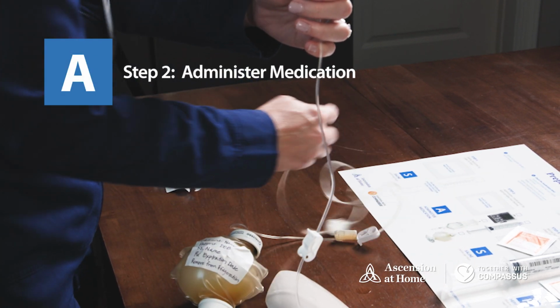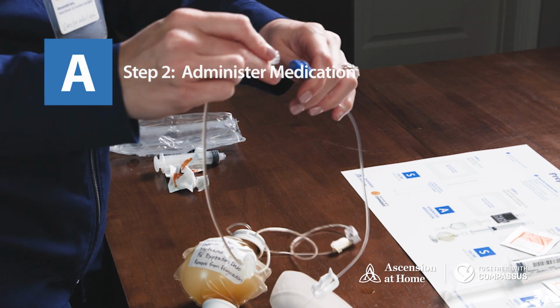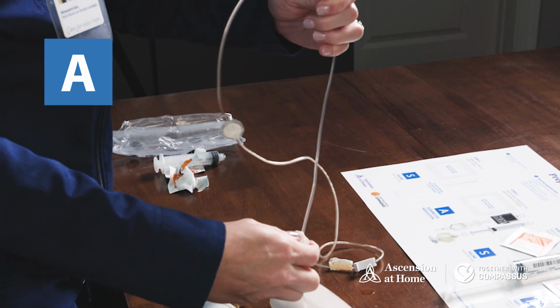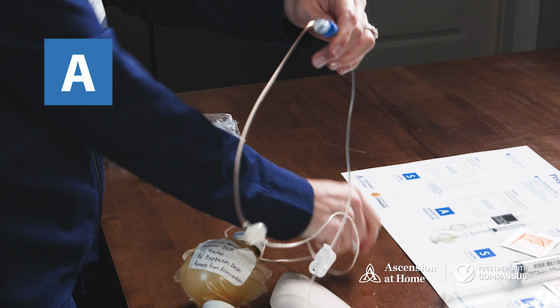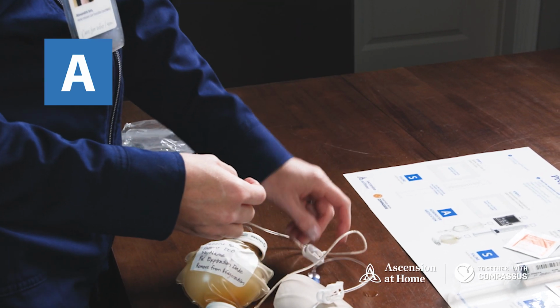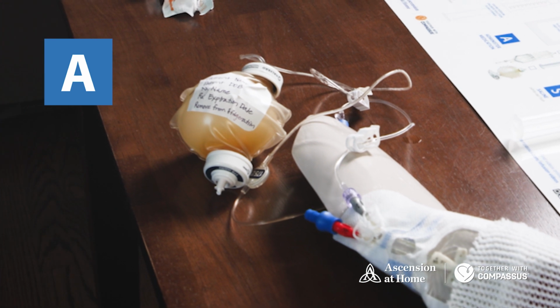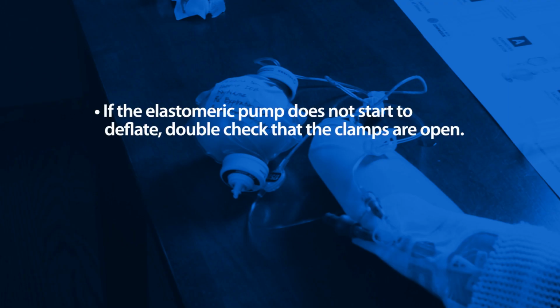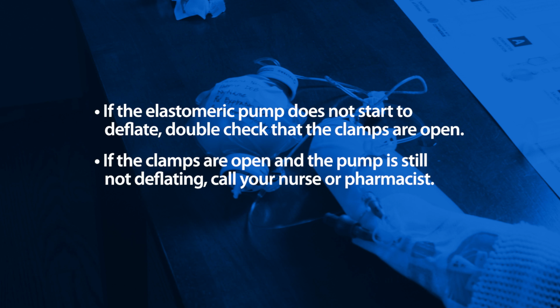Remove the cap from the elastomeric pump tubing. Attach the tubing from the elastomeric pump to the clave by using a clockwise twisting motion. Once connected, unclamp the tubing. Your medication will run over a specified number of minutes. If the elastomeric pump does not start to deflate, double check that the clamps are open. If all of the clamps are open and it is still not deflating, call your nurse or pharmacist.